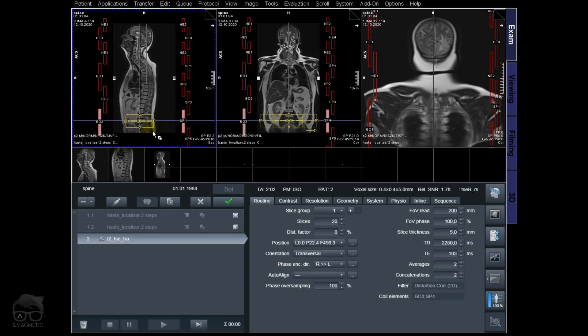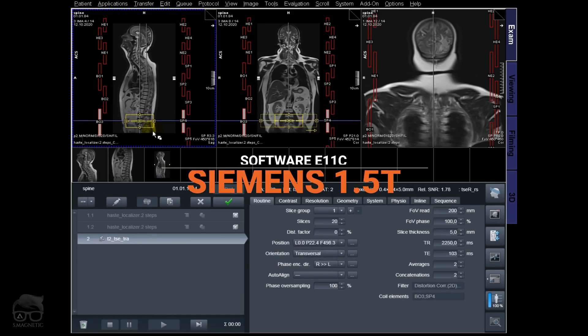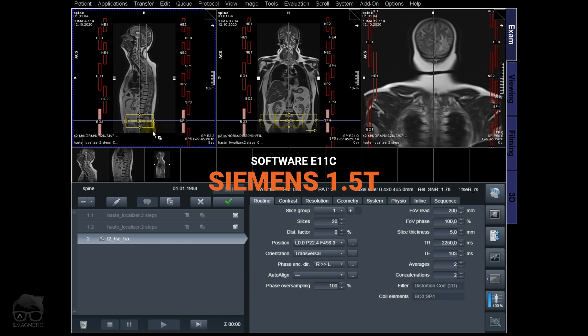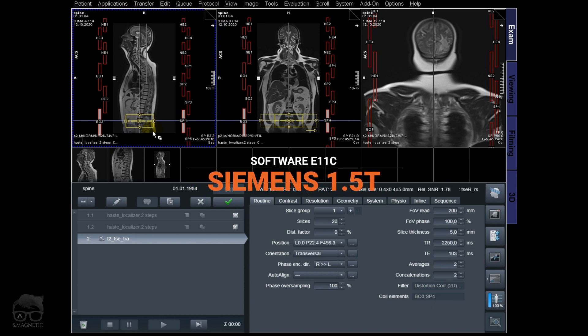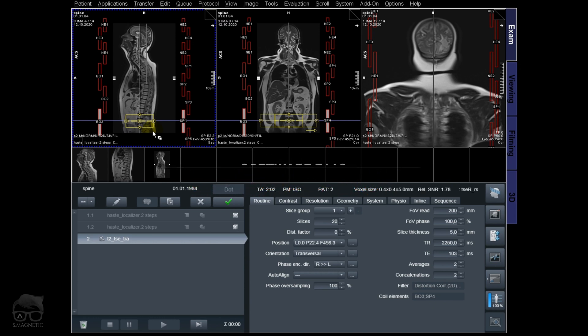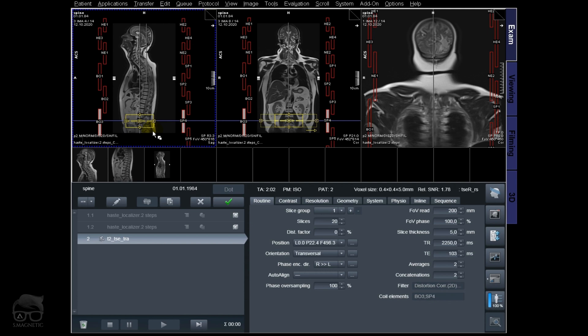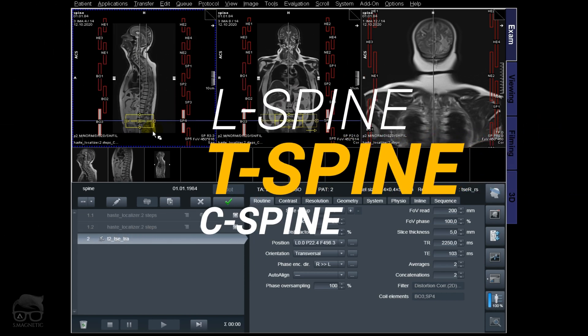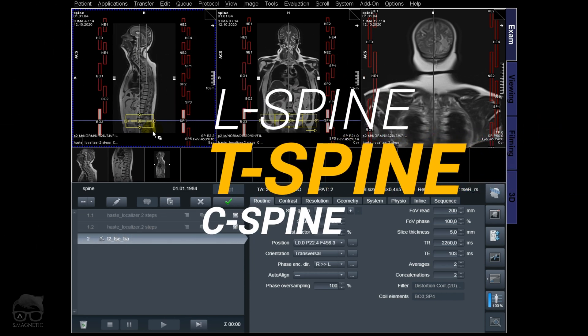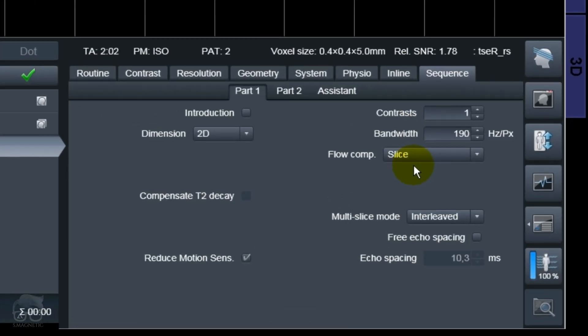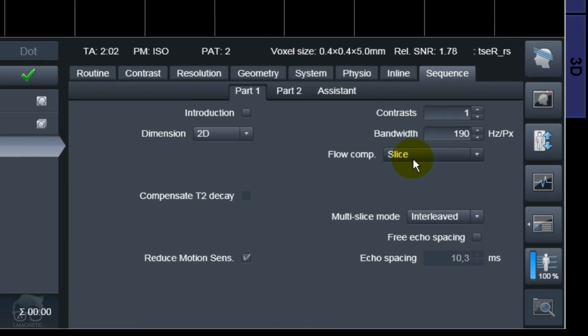We are live at 1.5T, but this will work the same on 3T. I already did a localizer here which covers the whole spine. Today I'm thinking about taking a standard T2 with and without flow compensation for three regions: L-spine, T-spine, and C-spine.